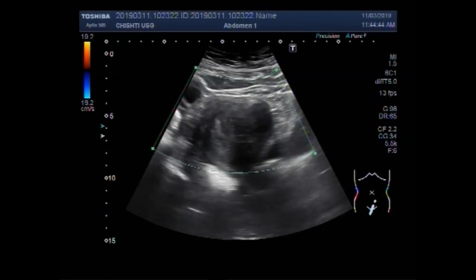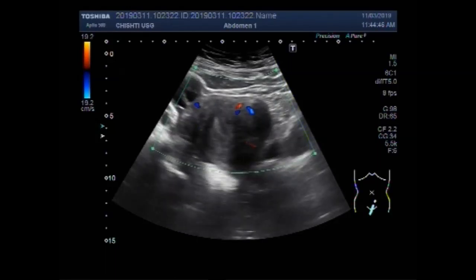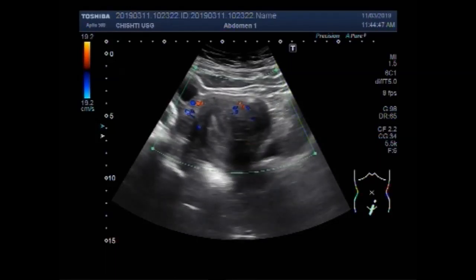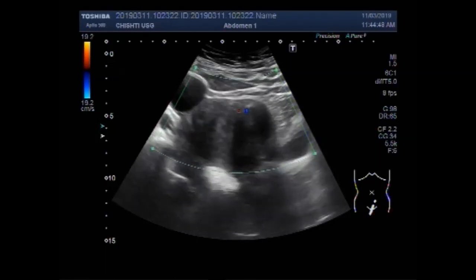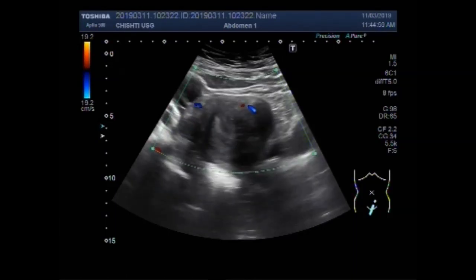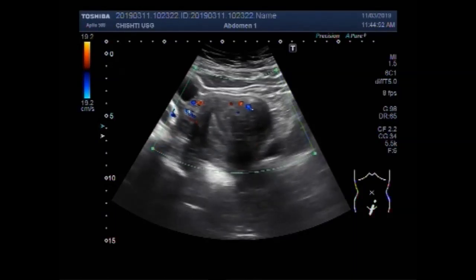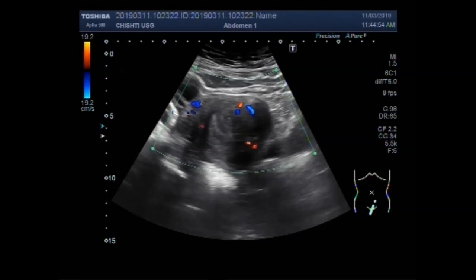Now you can see the blood flow in the masses. A fair amount of blood flow is seen, especially in the rim region.